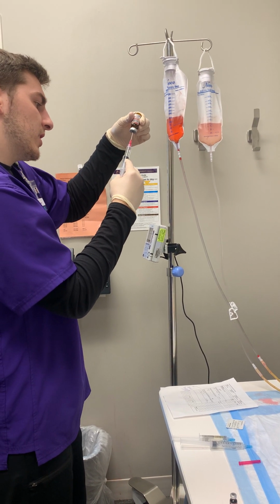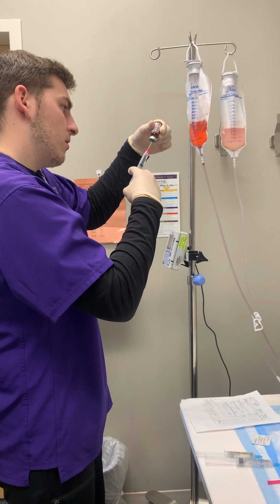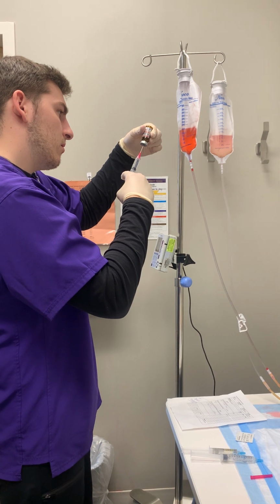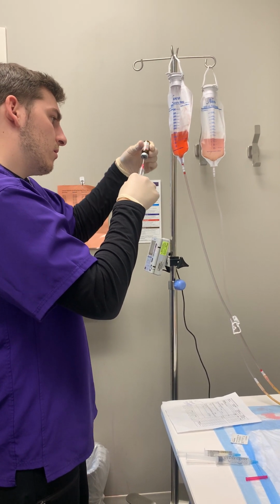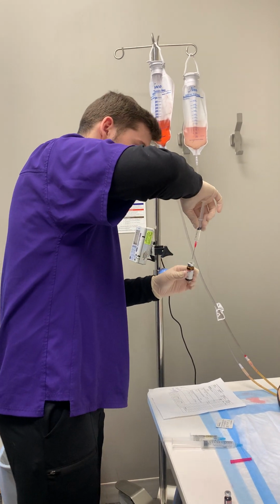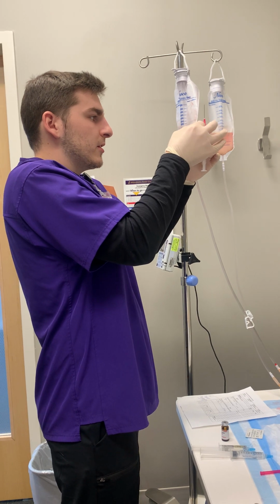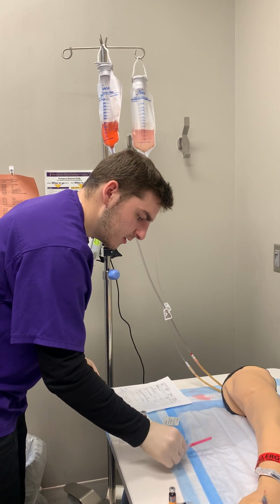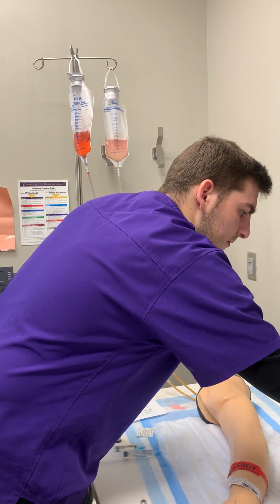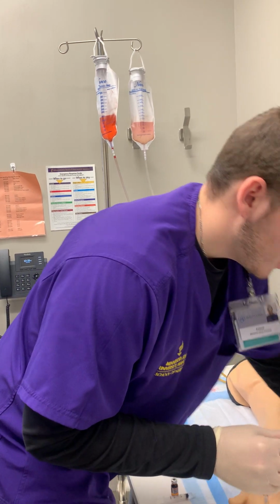Make sure I get all the medication. Alright. Then we're just going to get the couple of air bubbles out here. Looks like we do, and then we're going to recap this. Alright, and then same thing, I'm going to get rid of this in the sharps container.